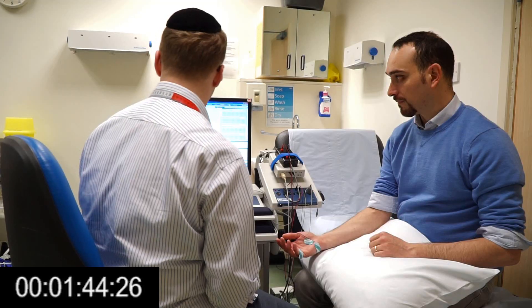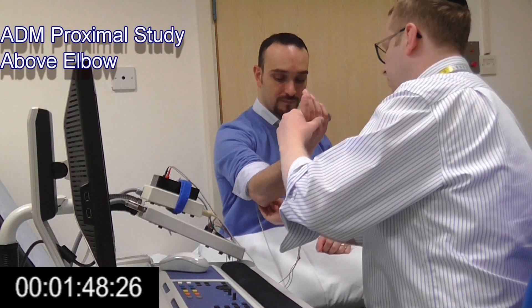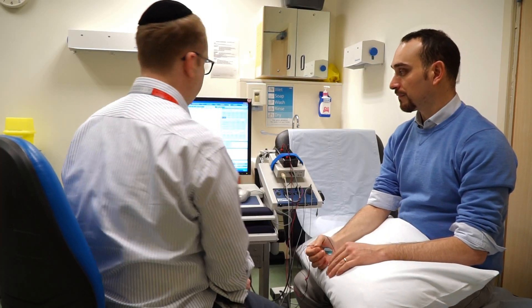Is that OK? Raise your elbow forward for me. If we were doing more formal studies of the ulnar nerve, we'd take it in a little bit more depth, but this is just for screening purposes.